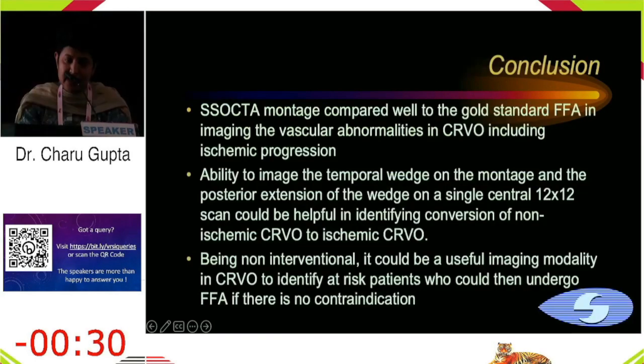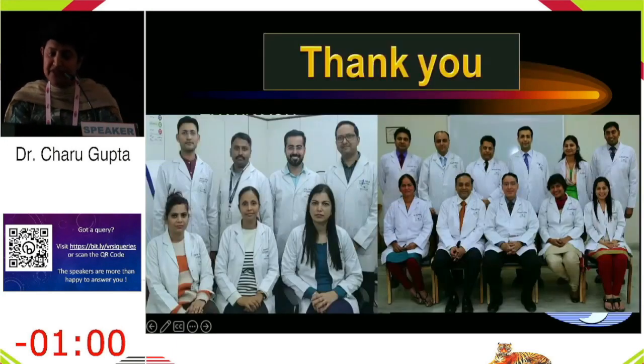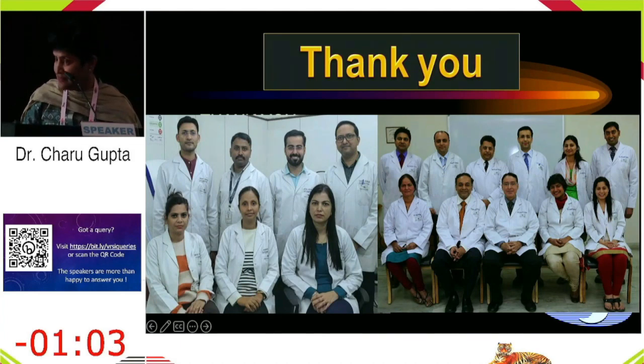In conclusion, I would like to say that the SSOCTA montage compared very well to the gold standard FFA in imaging the vascular abnormalities in CRVO, including ischemic progression. It has an ability to image the temporal wedge on the montage, and the posterior extension of the wedge on a single central 12x12 scan could be helpful in identifying a conversion of a non-ischemic CRVO to ischemic CRVO. Being non-interventional, it could be a useful imaging modality in CRVO to identify at-risk patients who could then undergo FFA if there's no other contraindication. Thank you.